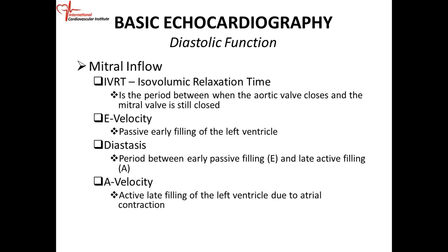Then after that, the atrium contracts and pumps blood into the ventricle. And we get what we call the A velocity. So the A velocity is the active late filling of the left ventricle due to atrial contraction.